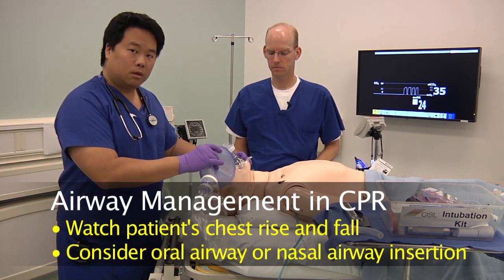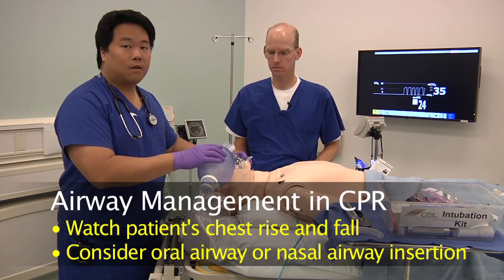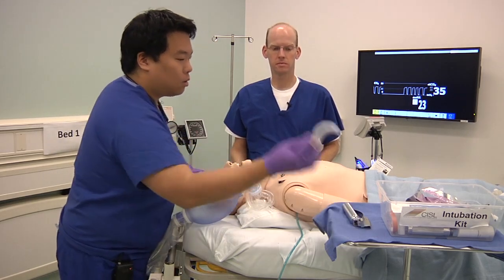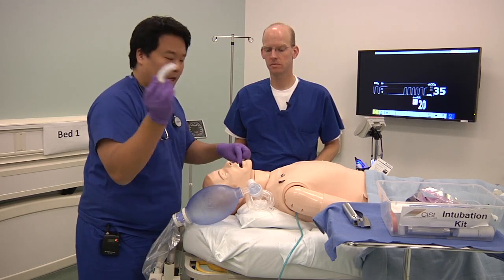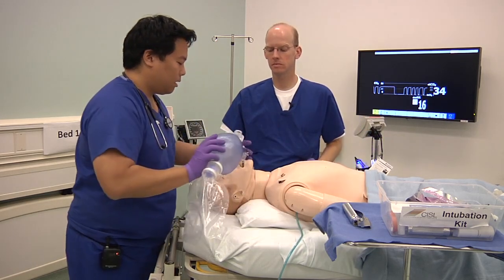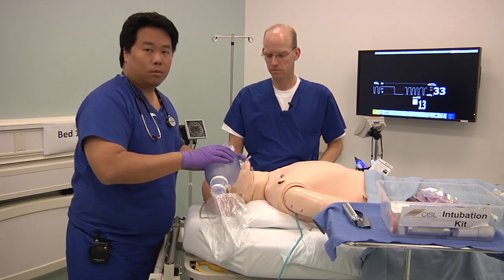If you have difficulty, there are things that you can do to help facilitate mask ventilation of a patient. One of the most common things is insertion of an oral airway. You can take an oral airway here, and you can insert it into the patient's mouth upside down, and then turn it around properly, and then go ahead and try mask ventilation again, and see if that can help you.